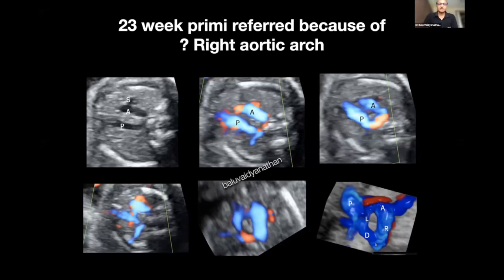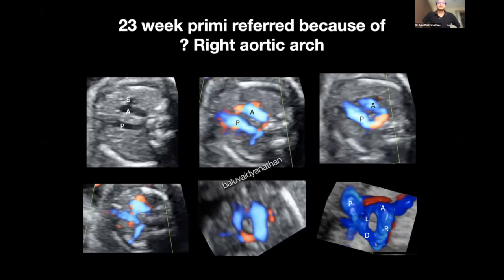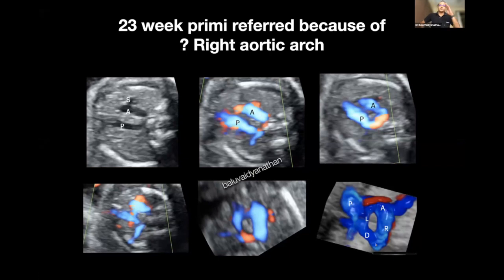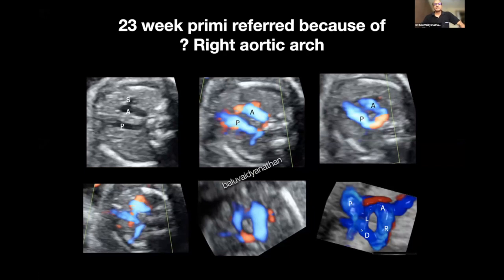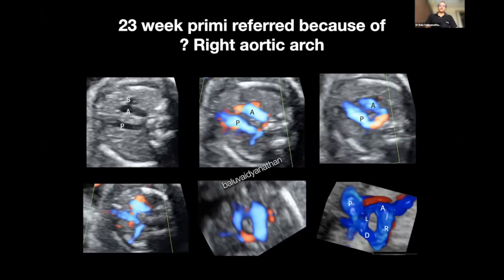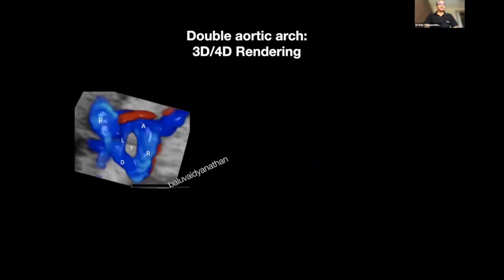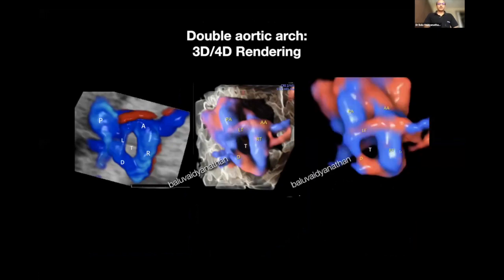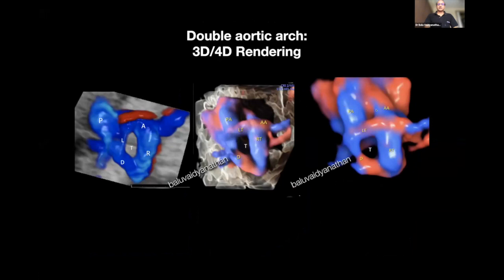The difference between right arch and double arch is that in right arch there is only one aortic arch, which is the right arch. In double arch, the aortic arch divides into a right branch — usually the dominant arch — and a smaller left branch. The left branch is seen anterior to the trachea, and the trachea is encircled between the left and right branches. This is beautifully shown in 3D rendering, where you can see the left arch, right arch, and ductus forming a complete ring.